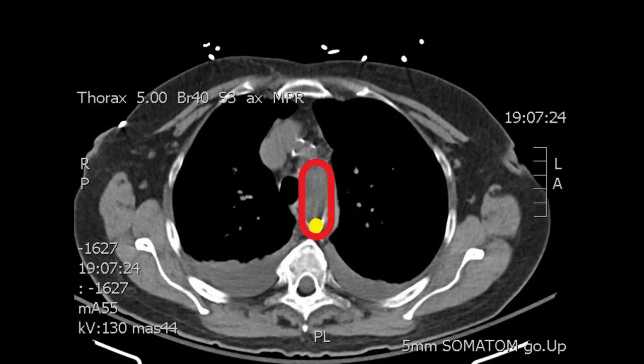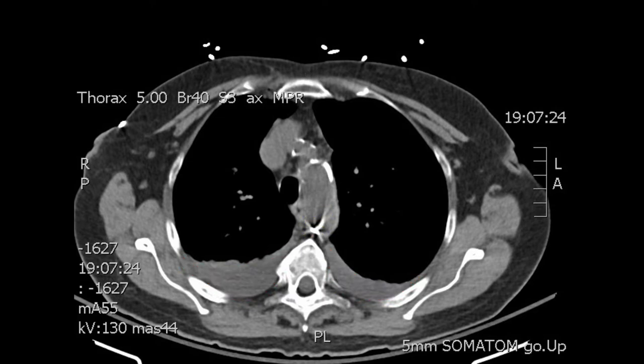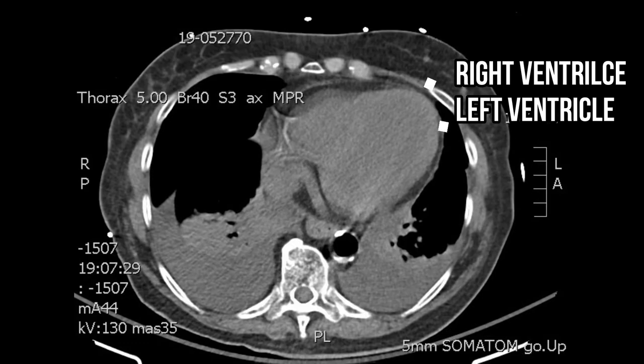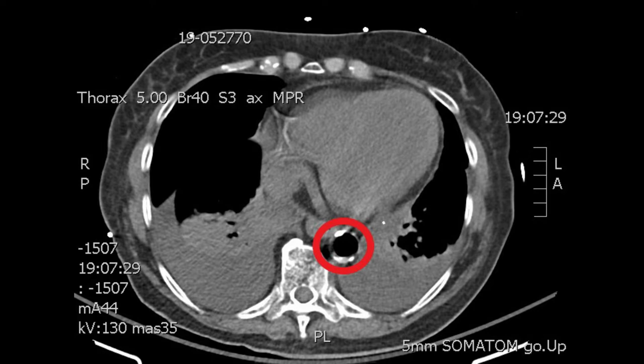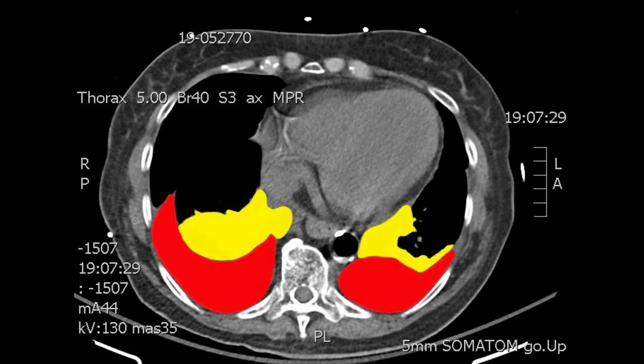As the CT goes from top to bottom, you will see the aortic arch in red, and some pleural effusion depicted in red. We're then going to see other images of the chest — the right heart and the left heart — and also in circle the descending thoracic aorta with black air inside.